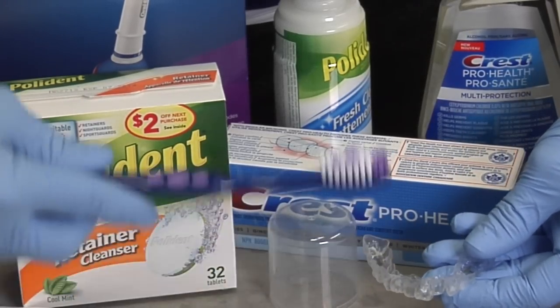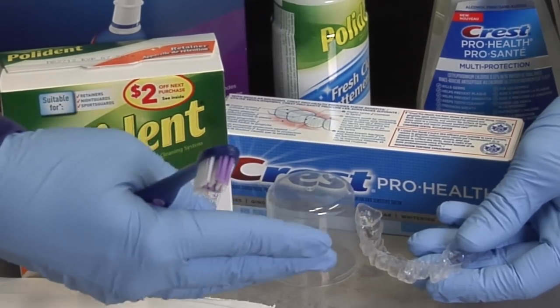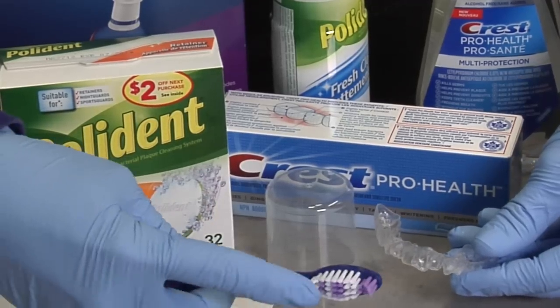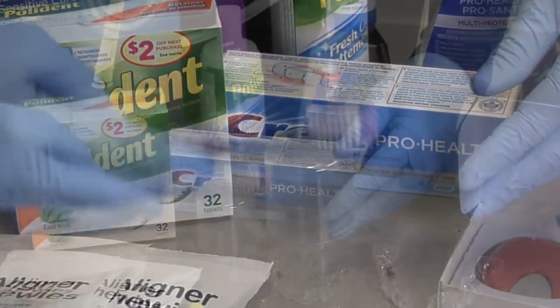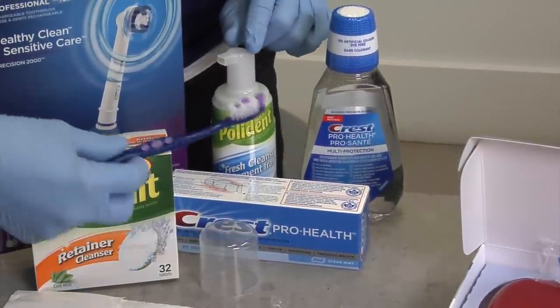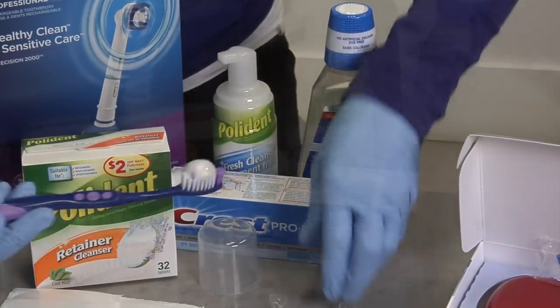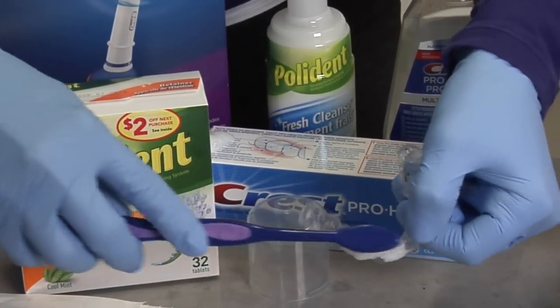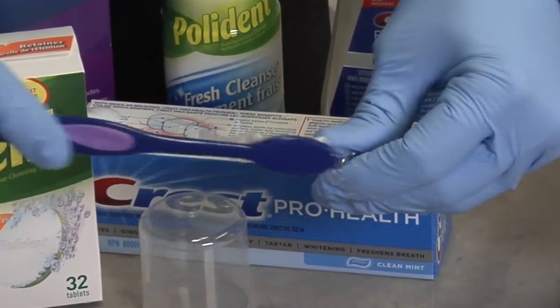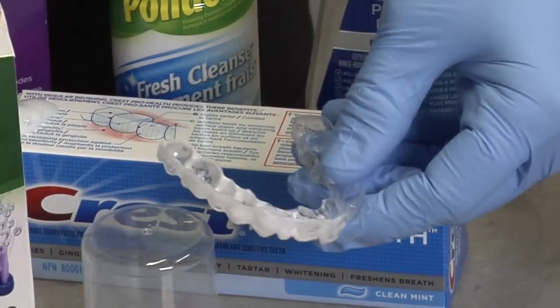As a rule of thumb, every time you remove the aligners to brush your teeth, you always want to clean the aligners. Just like bacteria will grow around the gums and on the teeth, they're going to grow on the aligners. Take a soft bristle toothbrush and use either a non-abrasive gel toothpaste or Polydent foam pump. Take your toothbrush, pump the foam onto the brush, and gently clean everywhere in the aligner — get into all the crevices, inside and out. You can do this every time you remove them to brush your teeth.